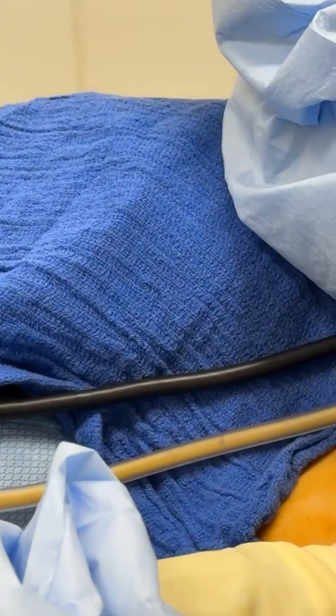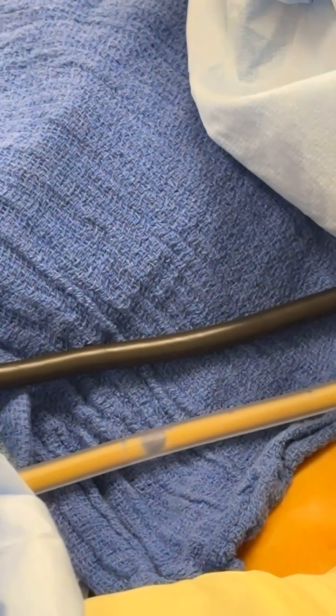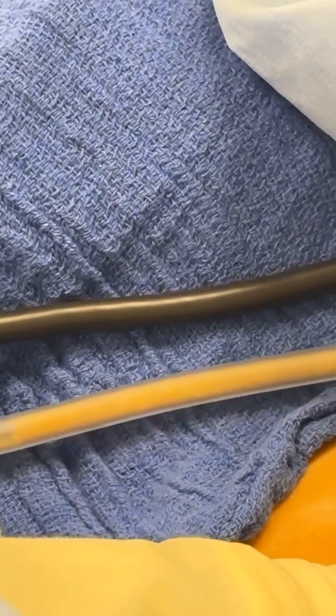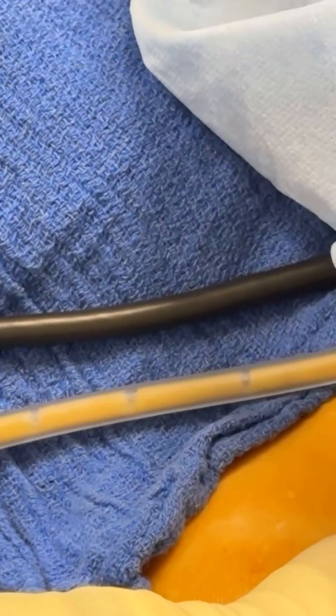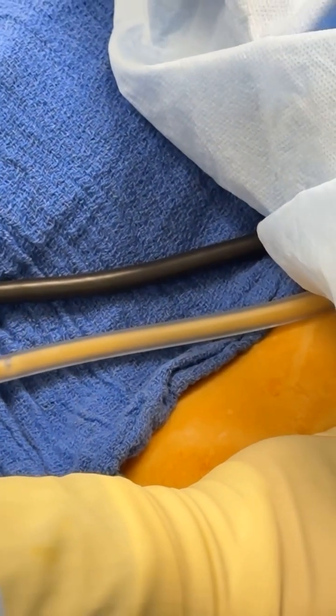It has many benefits for the patient. Number one, because you go so slow and your strokes are so calculated, there is going to be much less risk of an internal organ injury, right?